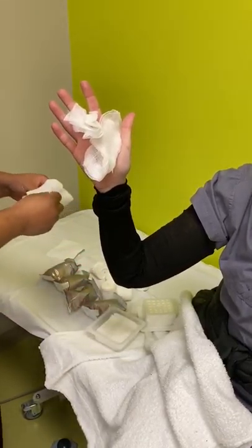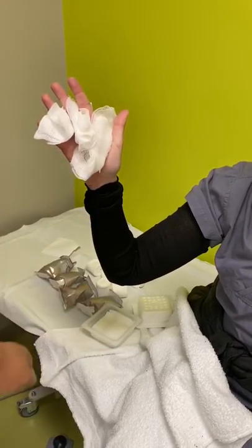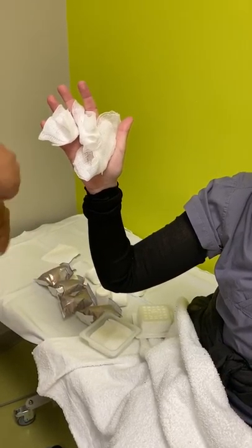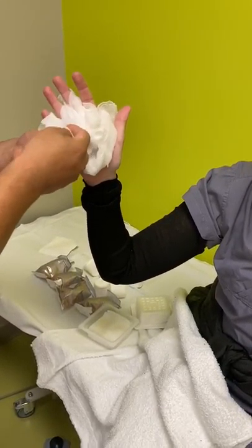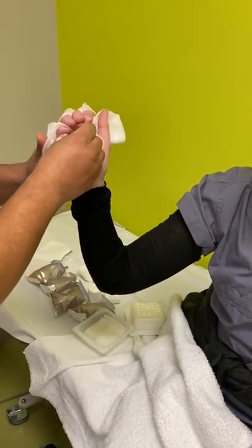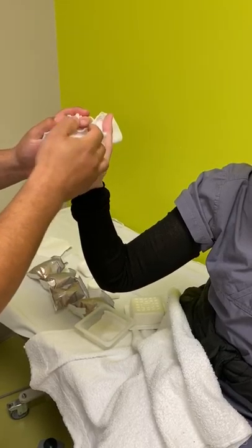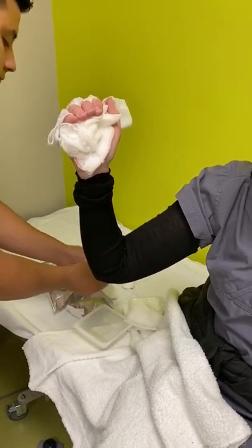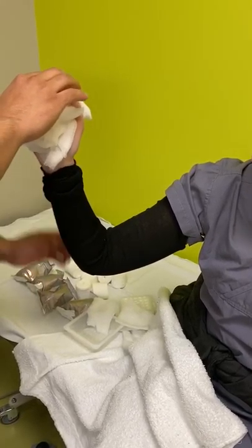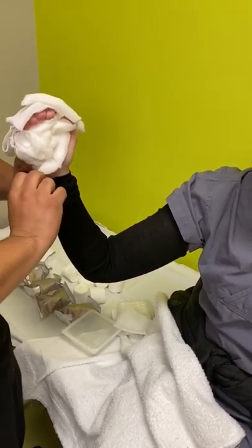We're demonstrating this on an adult patient. However, the times when you would use a mitten cast is typically on a pediatric patient under the age of about four. You would do it in instances of finger amputations or finger fractures. And you do a long arm cast with the elbow bent at 90 degrees so that the cast doesn't come off of a small arm, such as one on a four- or younger-year-old patient.